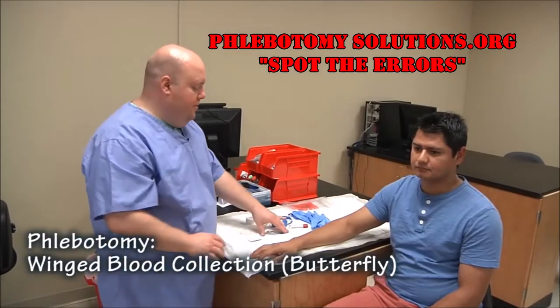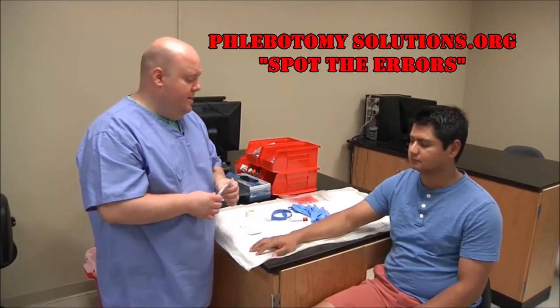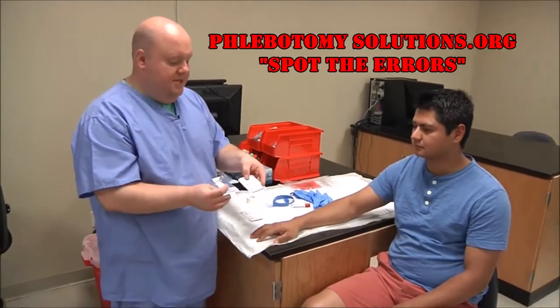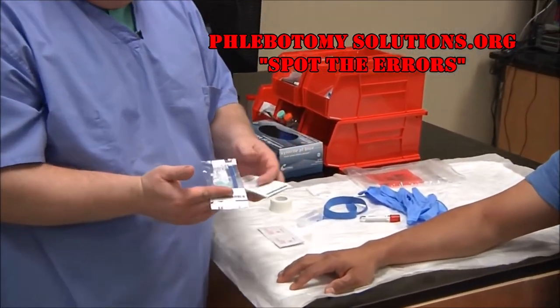This time we're going to talk about the winged blood collection set, also commonly called a butterfly. There are different name brands and different styles and packaging, so you want to make sure you choose the right one to suit your patient.